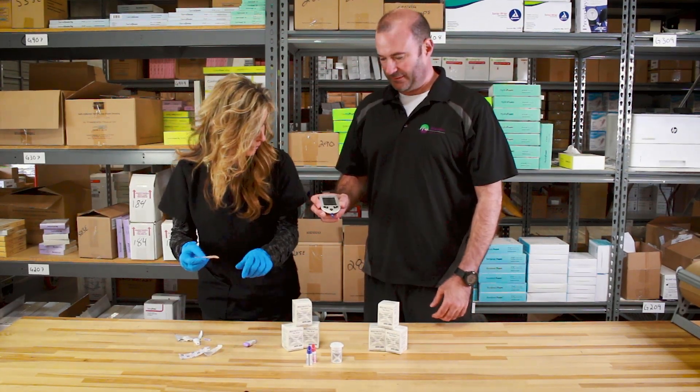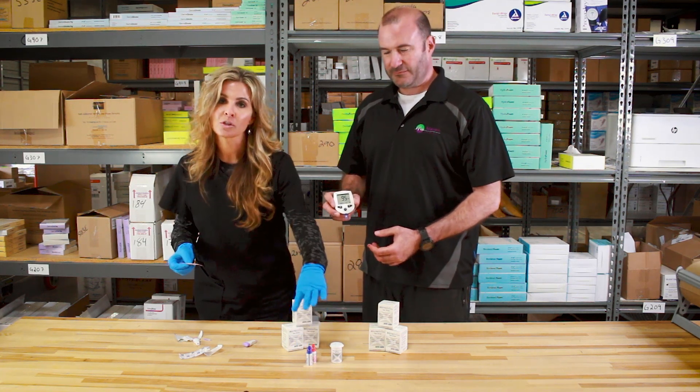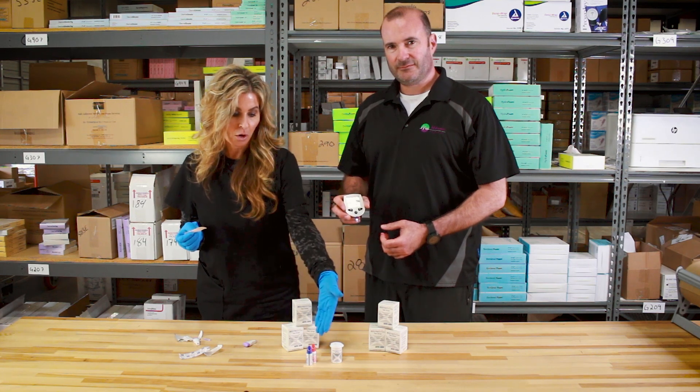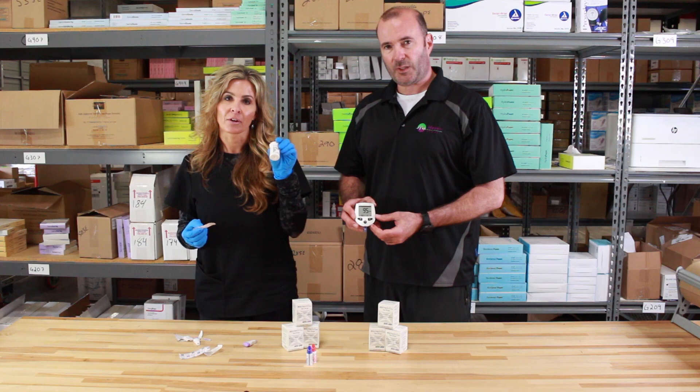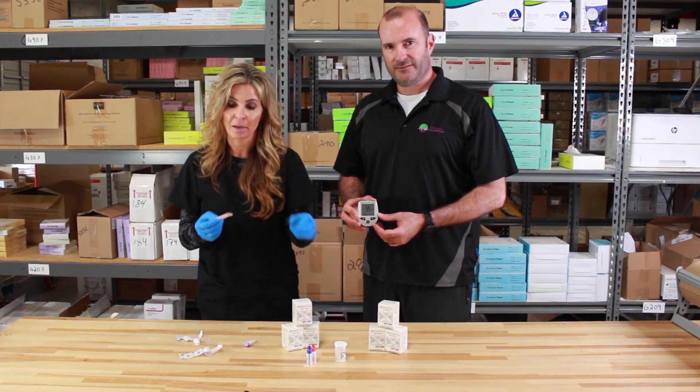And as I said, 95 — that's not too bad. These are the high-low solutions, so you can actually test to make sure that the meter is working correctly. The blue is the low, the red is the high, and they have the ranges on the bottle of strips. There are 50 strips in a box. It's actually one of our fastest selling products on the Medical Maven right now.